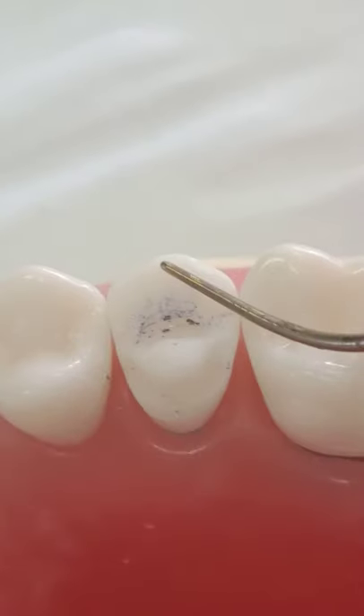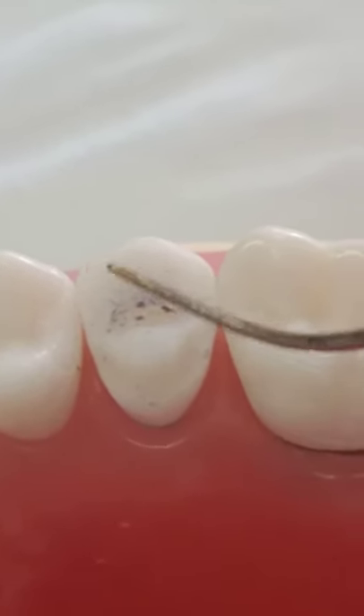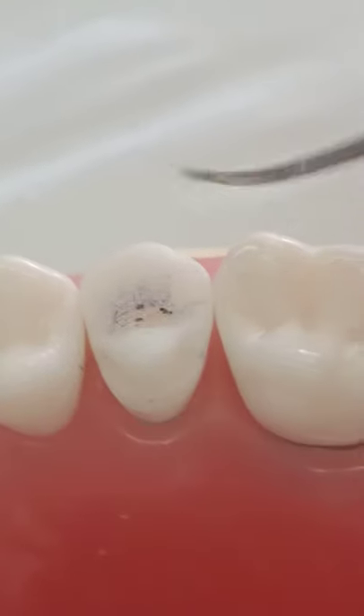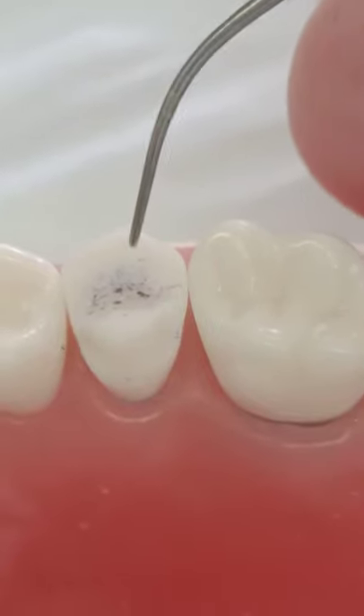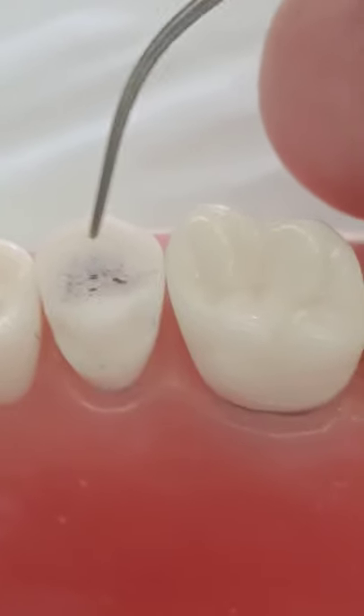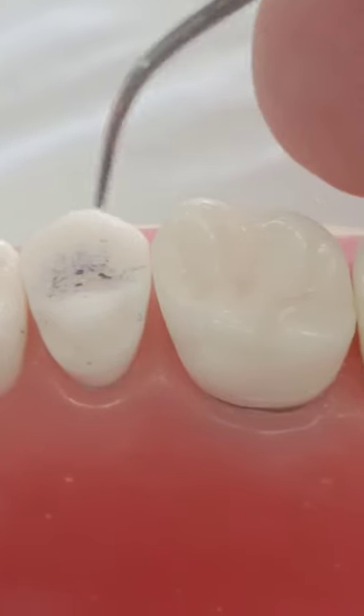Looking closely, I think you need a bit more reduction, especially on this side. But the direction of the bur was correct. I have a butt joint between the enamel and the restoration that will come — this is excellent. Rounded angles remaining, and dentine is enough.